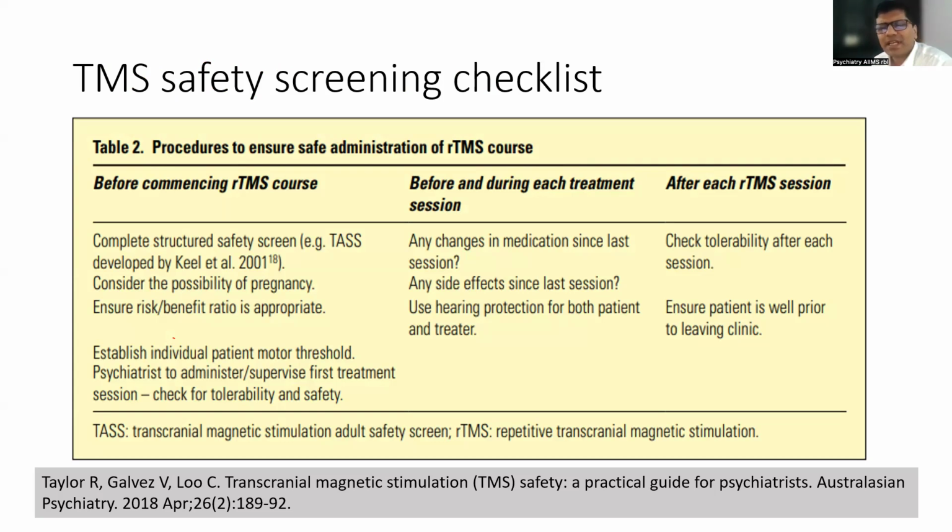Mostly the contraindications of rTMS are similar to the contraindications of MRI, so you can refer to that. And as rightly pointed out by Dr. Anurag, if somebody has undergone MRI in the recent past, that person is fairly fit for rTMS, because that person might have gone through that checklist before going for MRI.